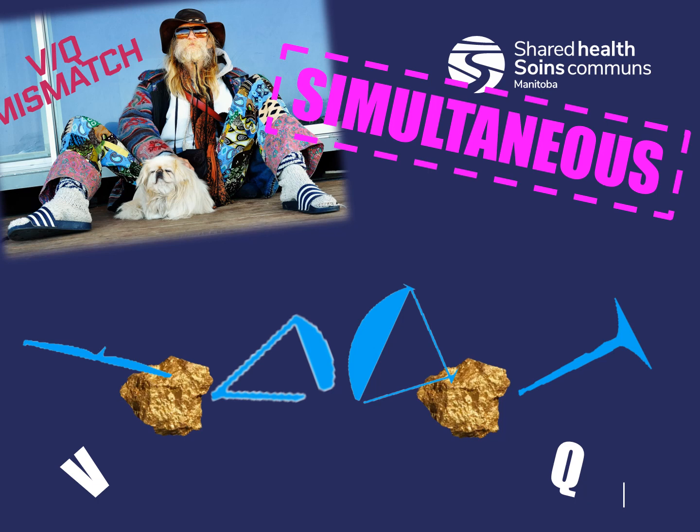And finally, the simultaneous VQ mismatch, because nothing can ever be simple. Many diseases cause the circulatory, respiratory, and/or metabolic components to simultaneously contribute to changes in end tidal CO2 levels. Think of a patient with pulmonary embolism. They'll be hyperventilating to compensate for hypoxia, thus decreasing the end tidal CO2, but will have compromised pulmonary perfusion due to the clot in the pulmonary vasculature, further decreasing end tidal CO2.